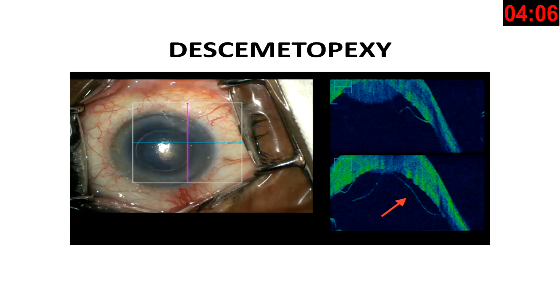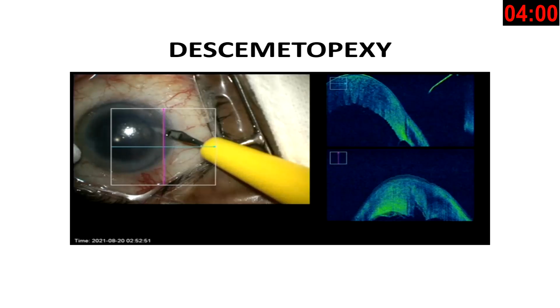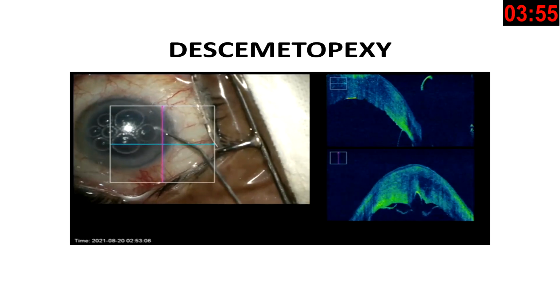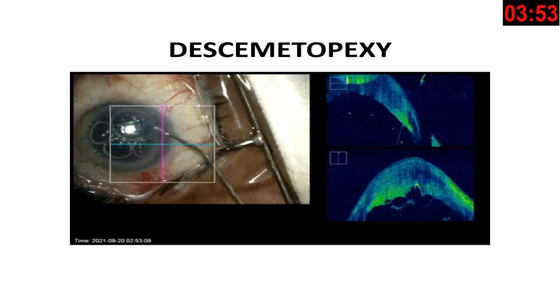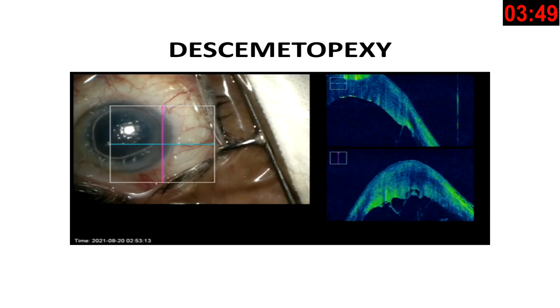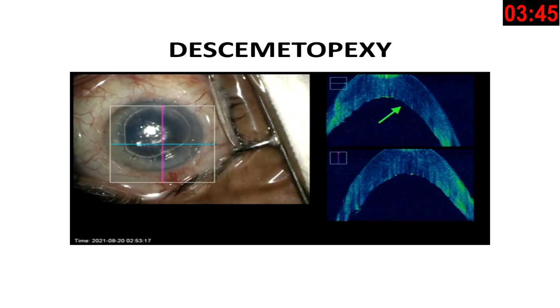So in this video, you can see this is intraoperative OCT. You can clearly see that there is a linear Descemet membrane detachment. Here I am making a side port, and we inject non-expansile SF6, and this is guided. So you know that you are going into the right plane, and you can see that as you inject SF6, there is immediate reattachment of the DM.